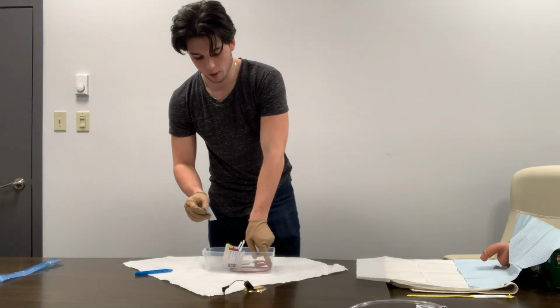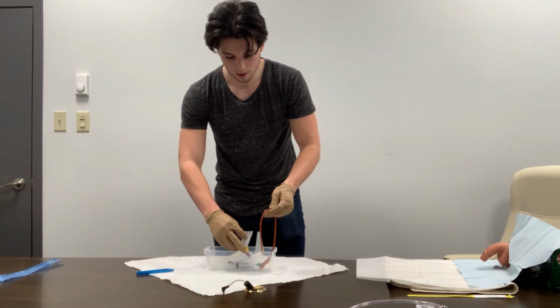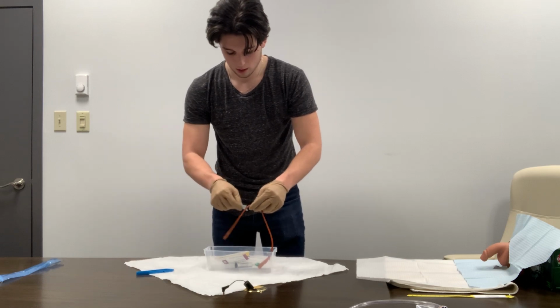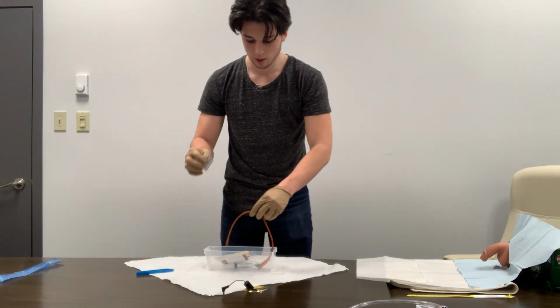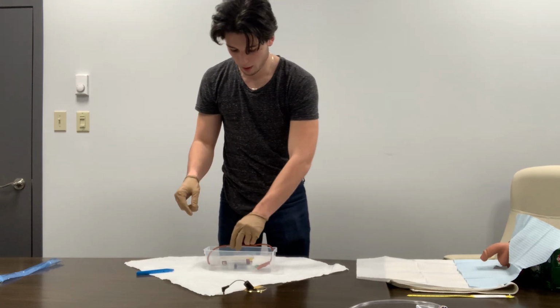And for this, since it's a male, we'll be lubricating about 6 to 8 inches of the end of the catheter. So we'll be lubricating all down the catheter on all sides. So yeah, we'll be lubricating about 6 to 8 inches there. And once that's well lubricated, we can throw this out, and we can place this back in our boat.